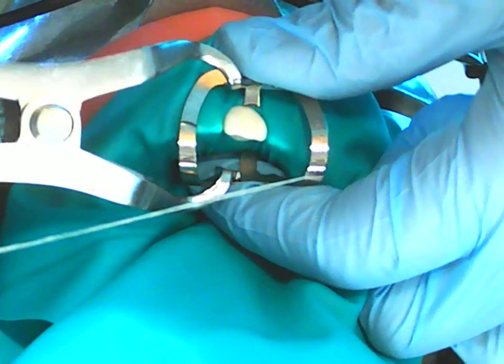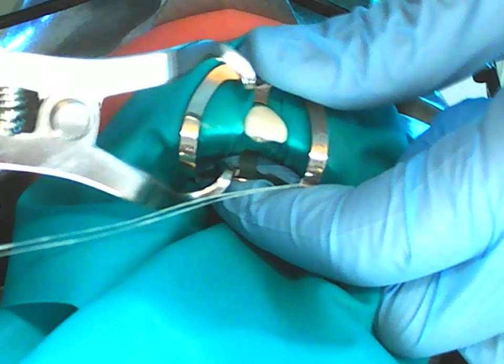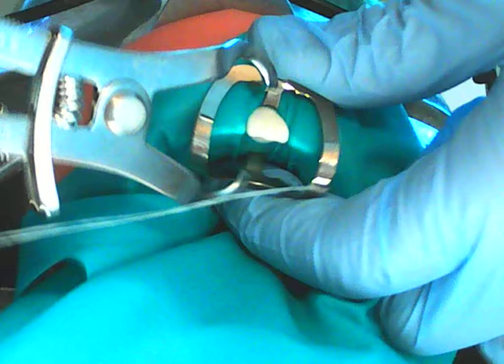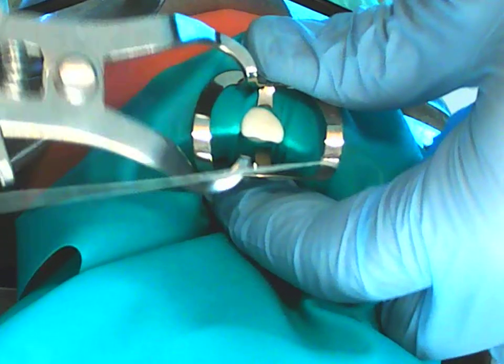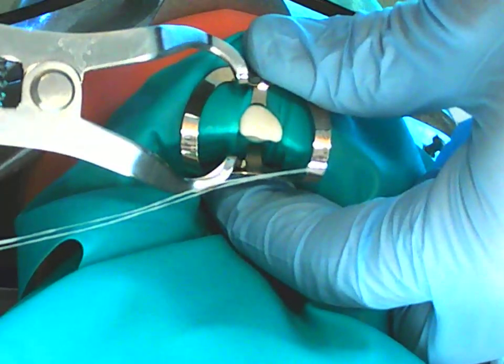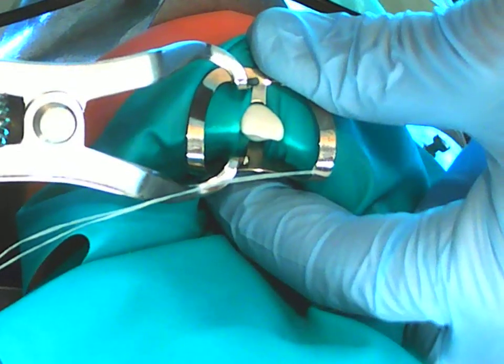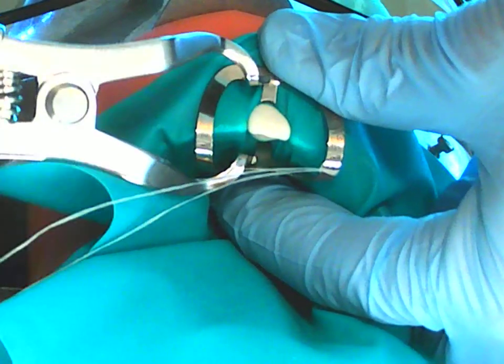Try to avoid dam getting caught under there. I felt myself go over the height of contour, which is great. Slowly release. You're going to have to use direct vision for the lingual because you cannot get your mirror in your other hand because it's busy.